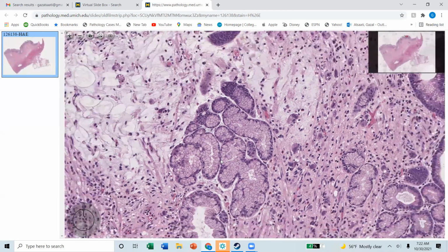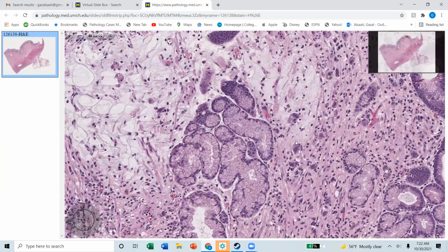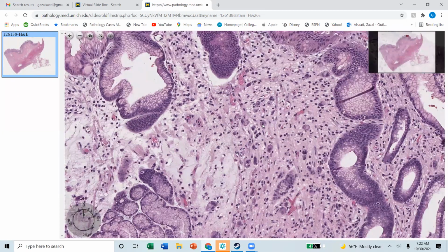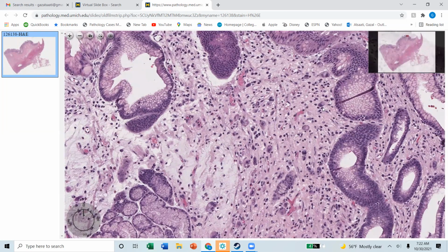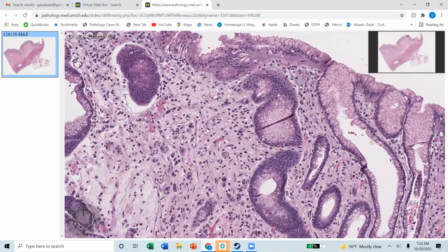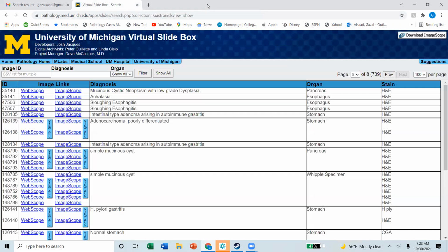And for this one, I'll definitely do a keratin on it if it was on a biopsy, because I'm not sure if these are tumor cells, which I think they are. These all are tumor cells. See them? Yes, very subtle. I mean, not the whole thing has tumor. You probably only have 10 here. There's this beautiful one over here. Yeah. Okay, so not the easiest diagnosis to make.